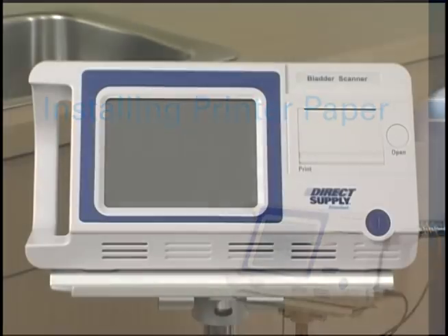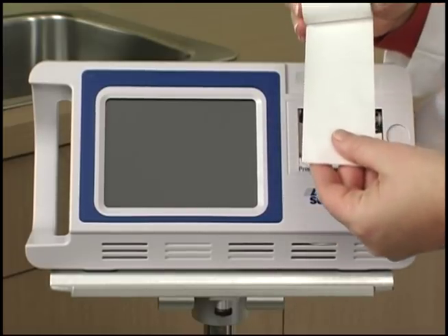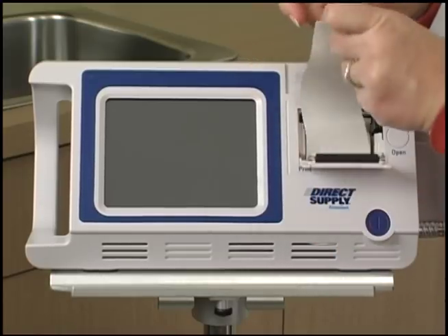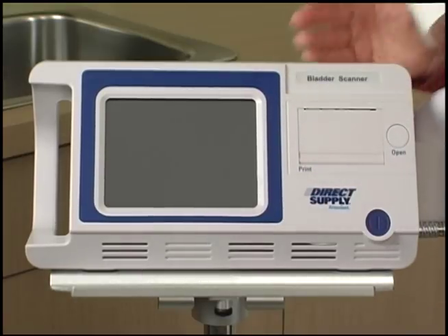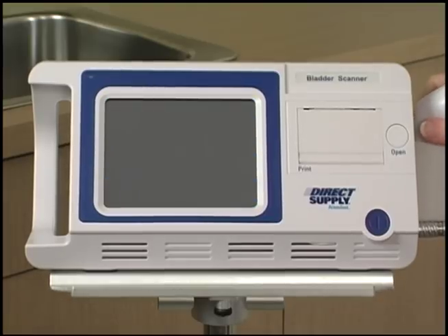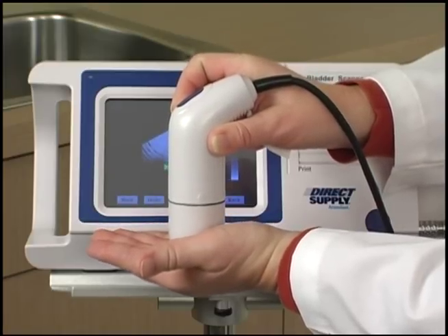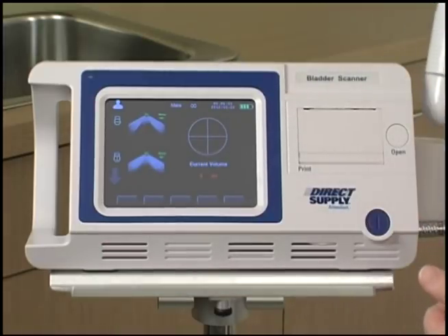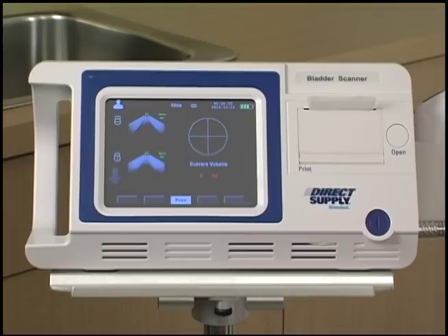To load a new roll of paper, first make sure the device is off. Press the open button to the right of the printer door — the printer housing will pop open. Insert the paper, making sure it feeds from the bottom of the roll. Pull one inch of paper from the roll, threading it out of the housing and closing the cover. Be careful not to jam the paper when closing the door. Turn on the bladder scanner, run a test scan, and press the print button to test that the paper was loaded correctly and the printer is working properly.